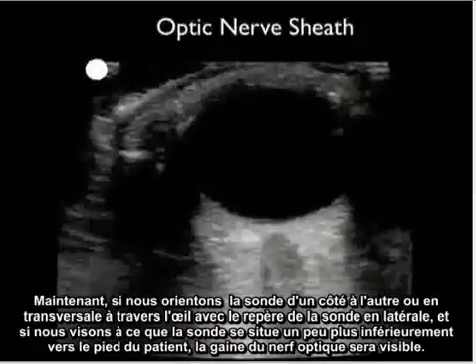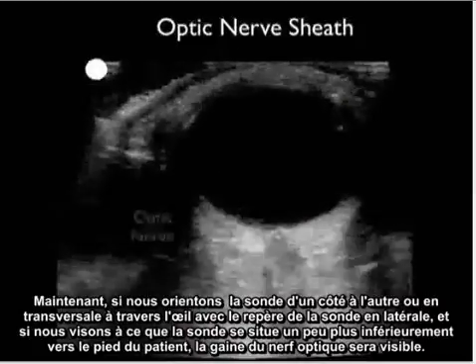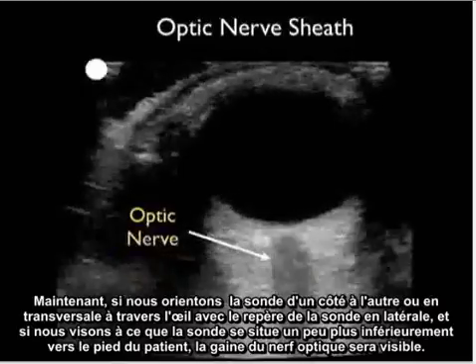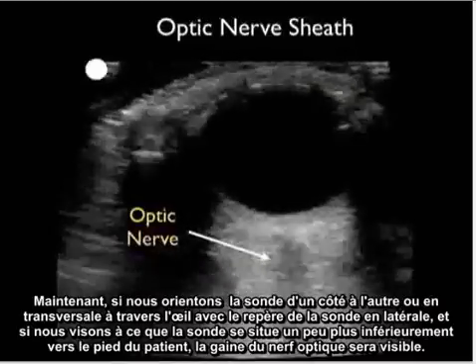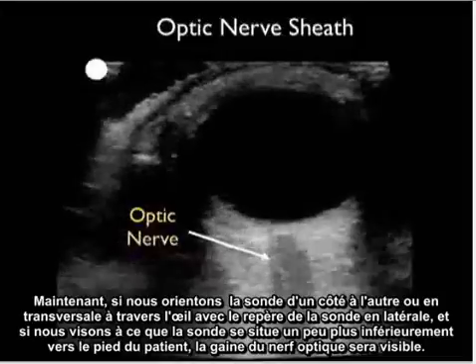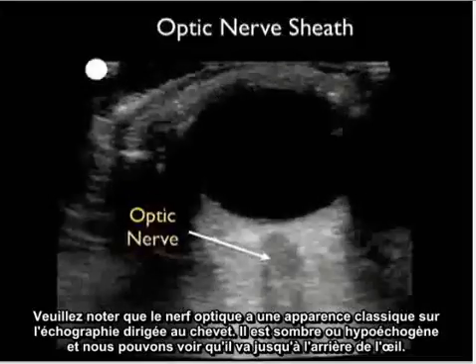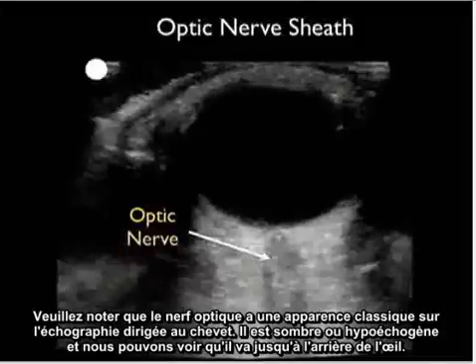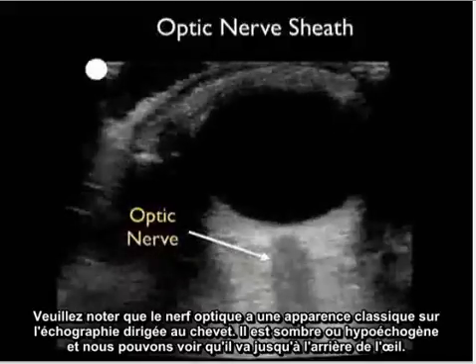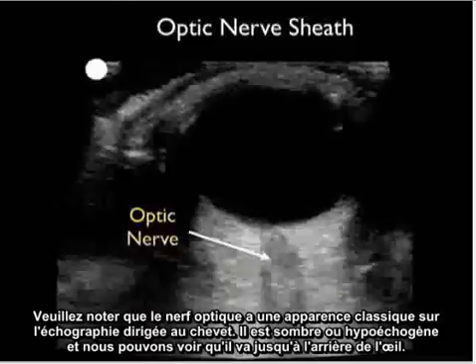If we aim the probe slightly more inferiorly toward the patient's foot with the transverse side-to-side orientation and probe marker lateral, the optic nerve sheath comes into view. The optic nerve has a classic appearance on bedside ultrasound: it is dark or hypoechoic, and can be seen leading right up to the back of the eye.